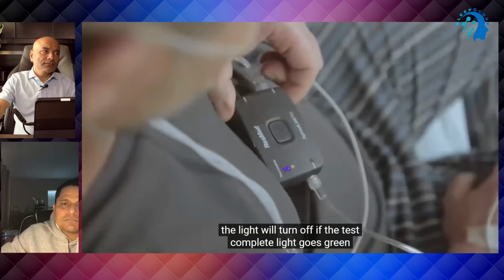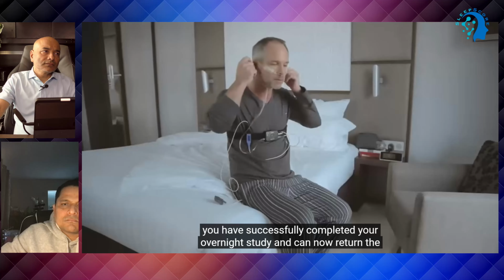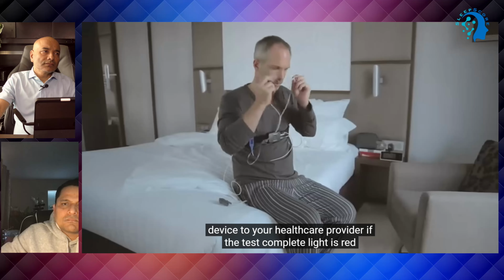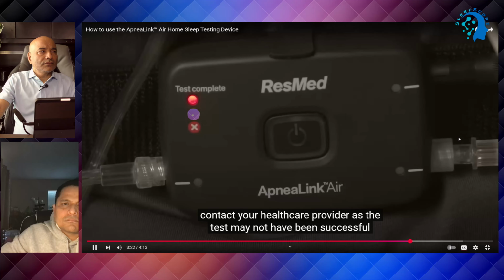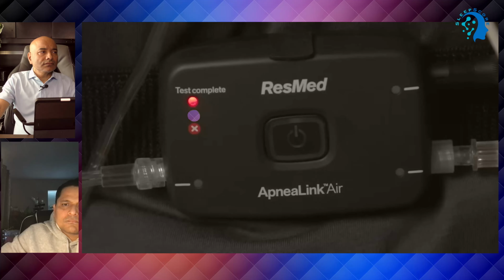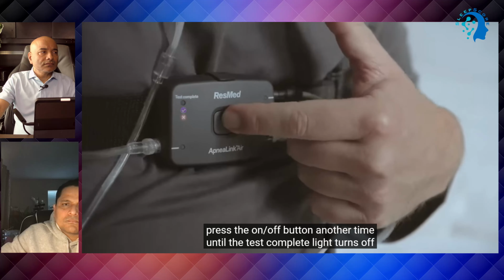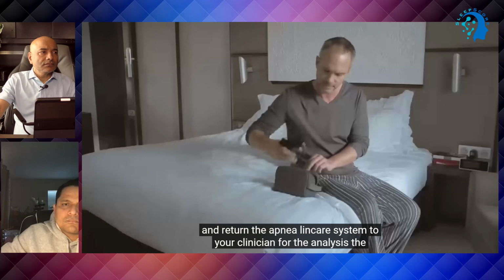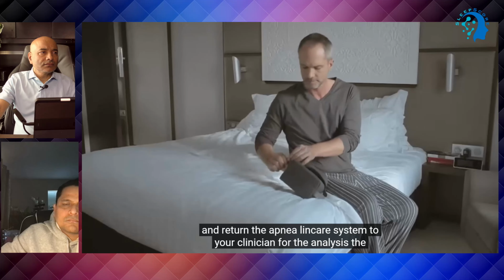If the test complete light goes green, you have successfully completed your overnight study and can now return the device to your healthcare provider. If the test complete light is red, contact your healthcare provider as the test may not have been successful. Press the on-off button another time until the test complete light turns off, and return the Apnea Link Air system to your clinician for the analysis.